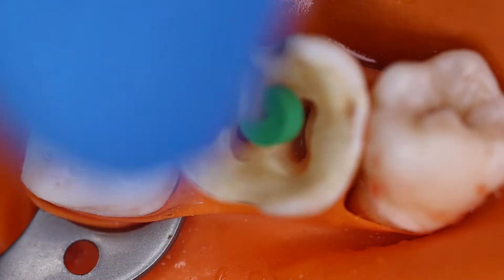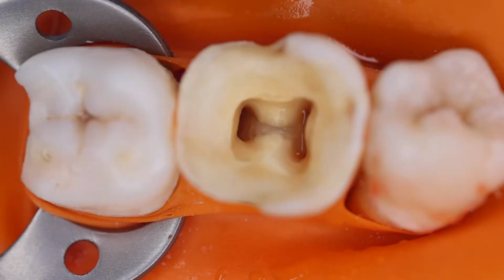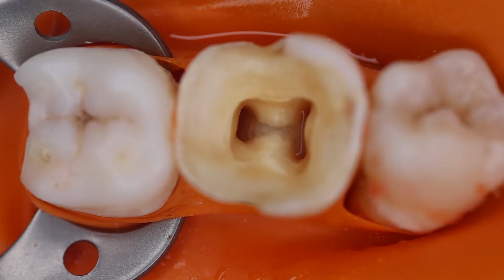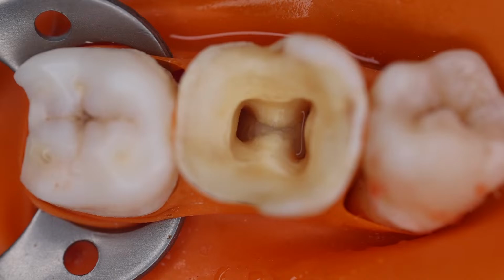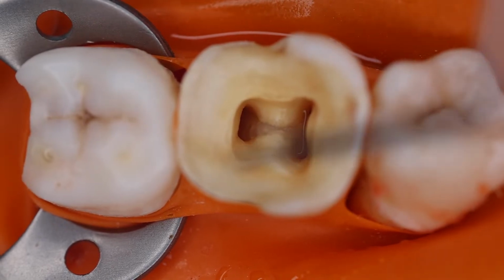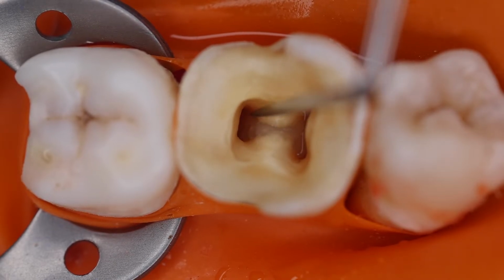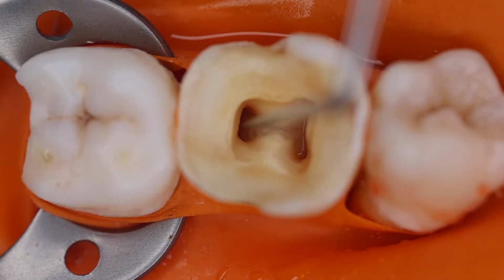Now for the distal we have got 19 millimeters, for the mesobuccal again 19, but for the mesolingual we have obtained 18. The thing to be considered here is that this is not the working length that we are going to prepare the canals for. For example, 19 mm in the distal canal means your working preparation should be a millimeter short.